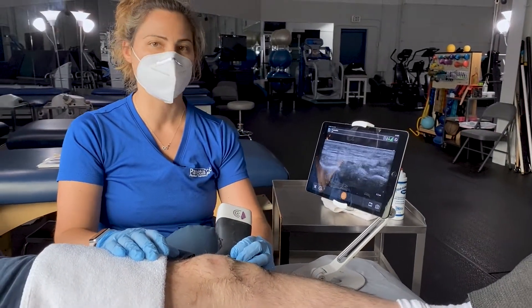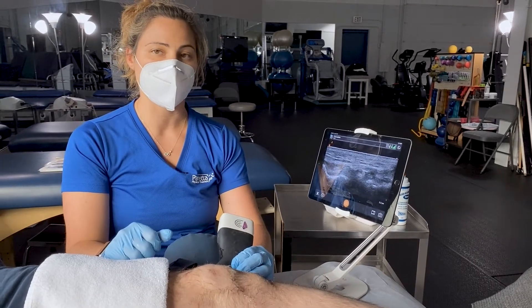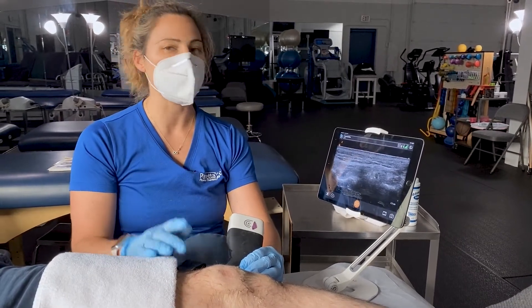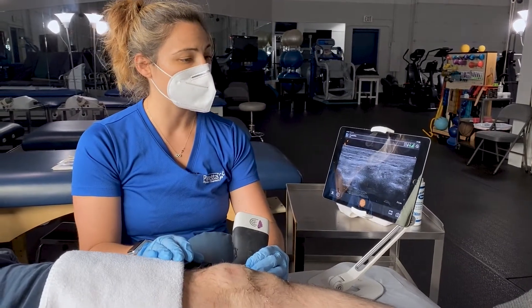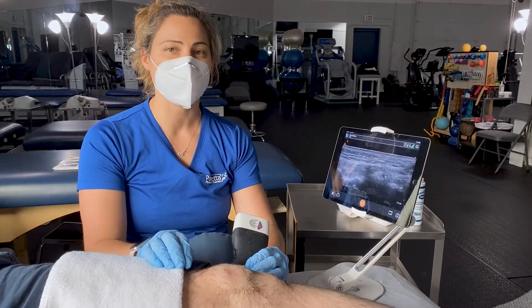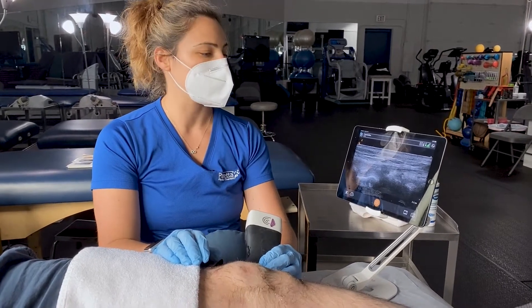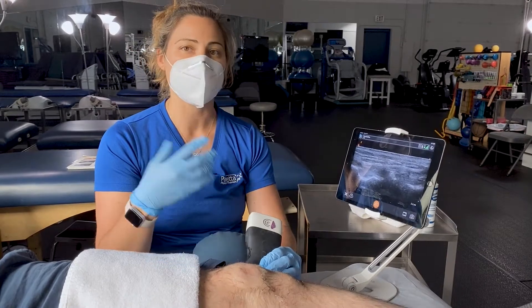Using sonogram is the same technique — it's the same type of technology that we use to look at a mother who's pregnant with a baby. But when we use it in this type of setting, we're really looking at the muscles, the bones, and the surrounding structures. It's very safe. There are really very few contraindications to having this type of exam on your knee, so for somebody who might not be a good candidate for an MRI, this is actually a great alternative. And we can still see a lot about what's going on with your knee.